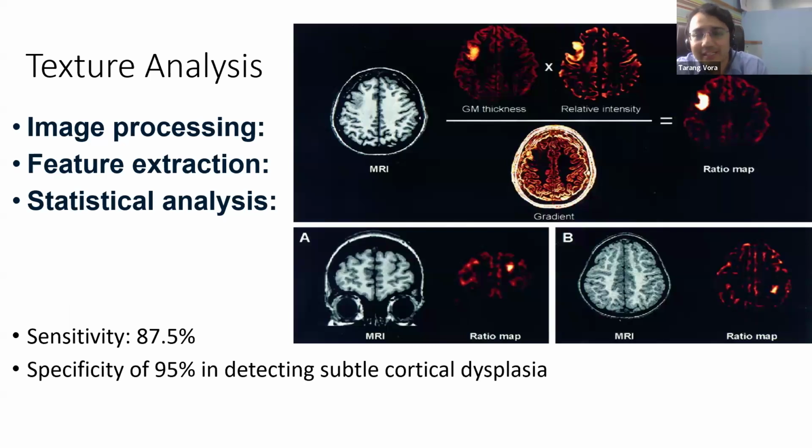And when we do that calculation, it gives us something called a ratio map. That ratio map is what shows us where the dysplastic tissue is. Now in this MRI on the left, you are seeing a dysplasia, and that is highlighted extremely well by the post-processing image. When we use that post-processing image with the navigation system available in our operation theaters, we are able to demarcate which area of the brain we want to resect.